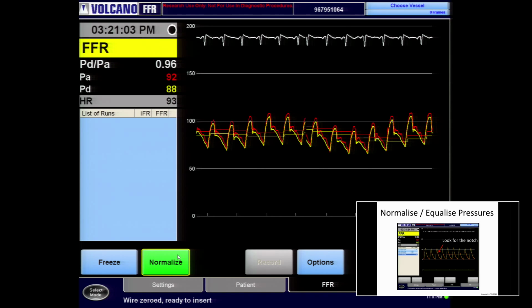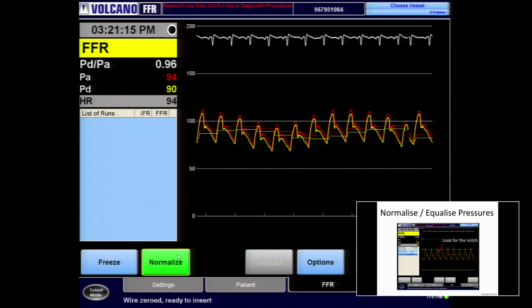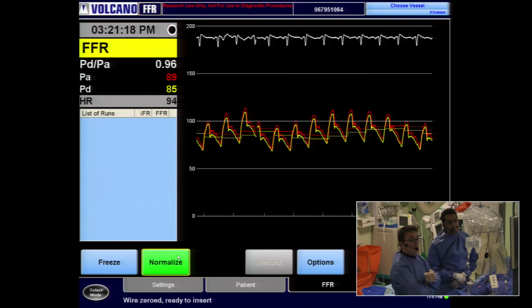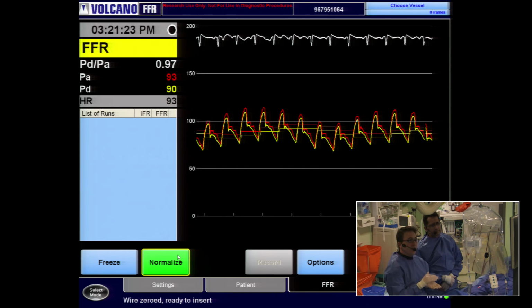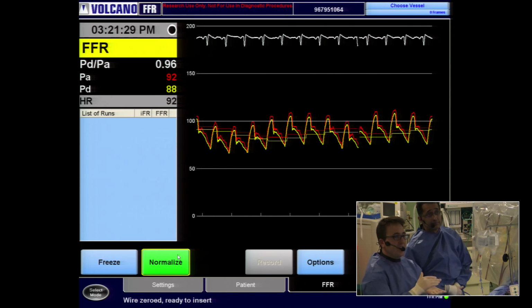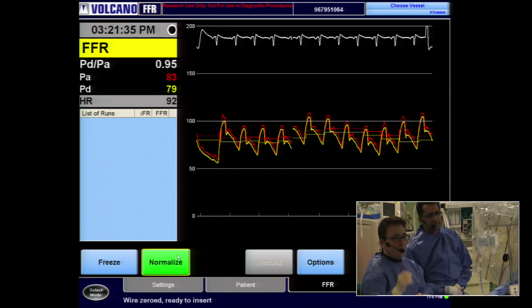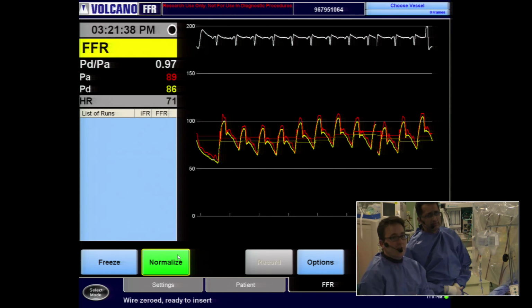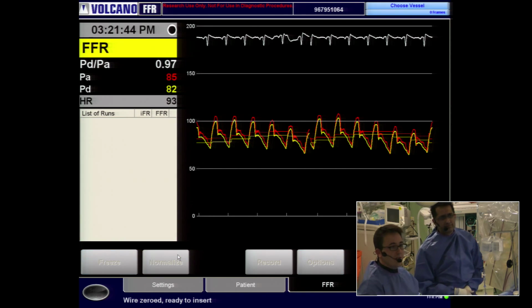So I think it's a very legitimate point to make, and I'm very careful about looking at the aortic pressure signal with that dicrotic notch really telling me that I don't think there is pressure damping. Okay, so we've got a good dicrotic notch, which is very, very important. So perhaps we could go ahead and normalise now. And I think what Iqbal's raised is a very, very important point, as you see from that slide, that it's very, very easy to have a ratio which essentially is 1 with effectively a very damped signal. And what we're looking for is the nice high-fidelity signals where you see all the bumps on the pressure trace. So you see the dicrotic notch, you see the anacrotic notch, you see the nice pressure decline. If you don't see that, you really need to think what's going on. So could we normalise? Oh, thanks very much.